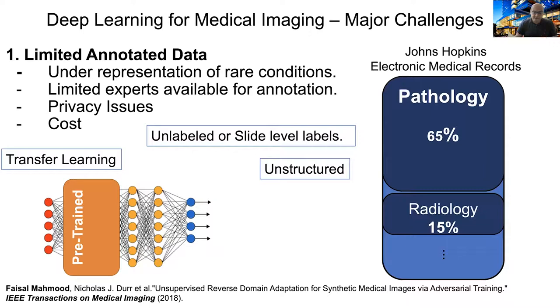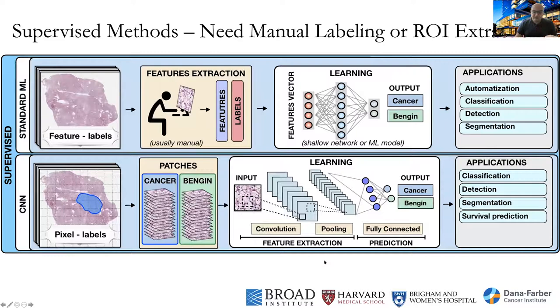And just to give a brief overview of what has been said already, there are two approaches to how you can train these models. There's a supervised approach or a semi-supervised approach where you have some form of annotation that is available on these whole slide images. Someone could have gone in and annotated this region, and you could train a deep model on top of that.